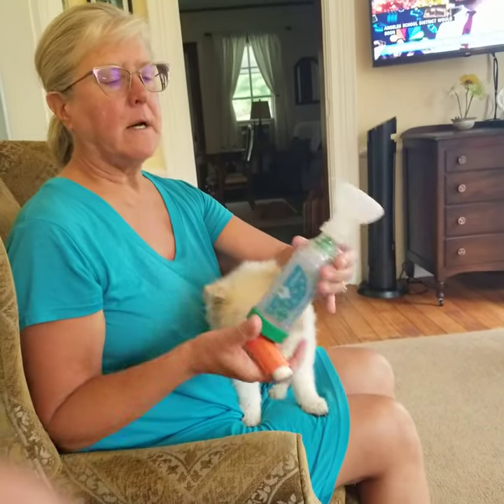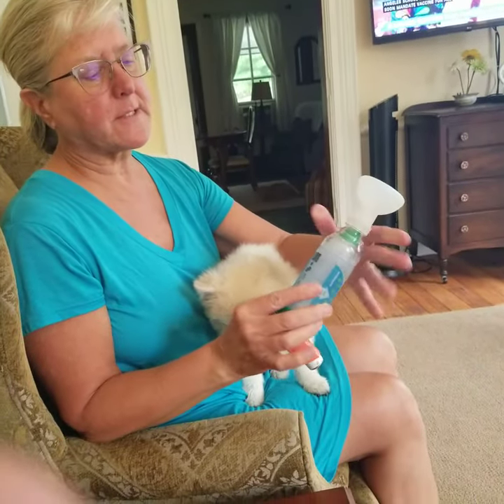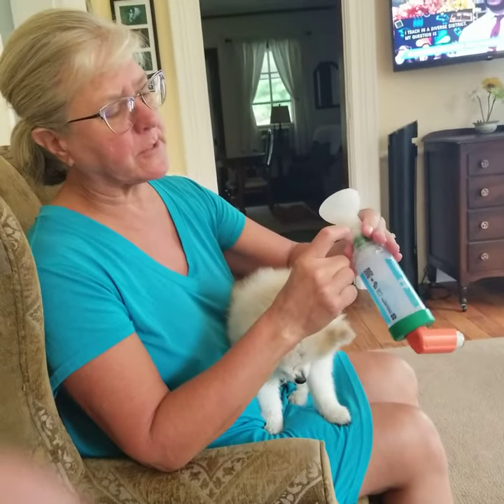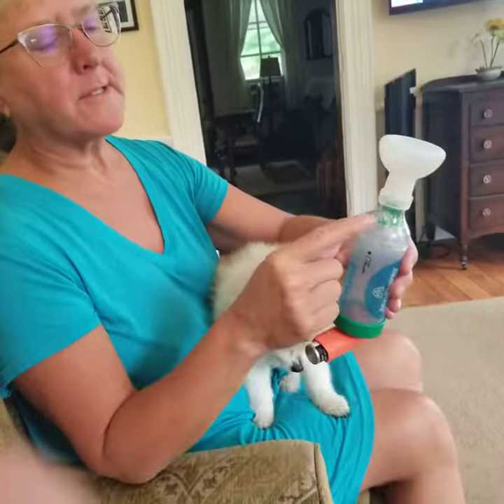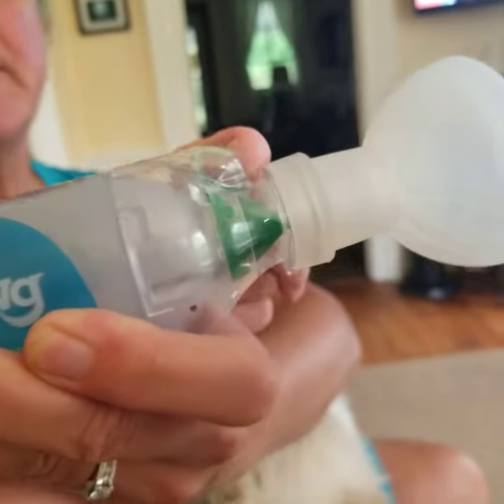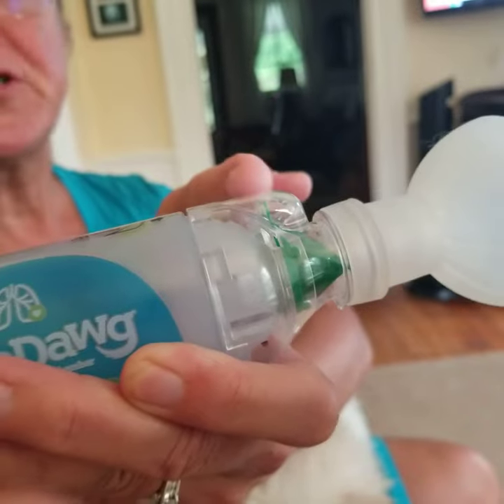This is what it looks like. Just make sure that this is secure and this is on — there's a little notch right there, just make sure that's okay. This is the flapper that you're going to be looking at; it will go back and forth when she's breathing.